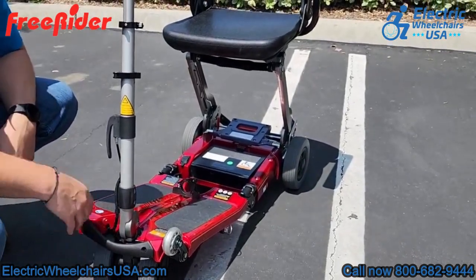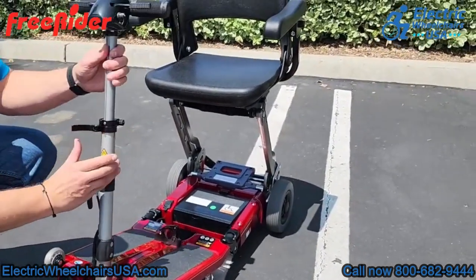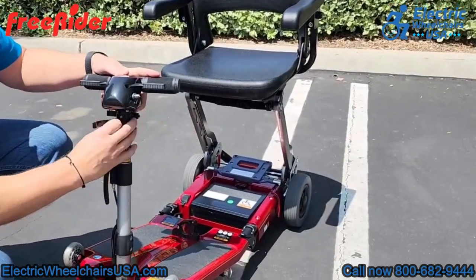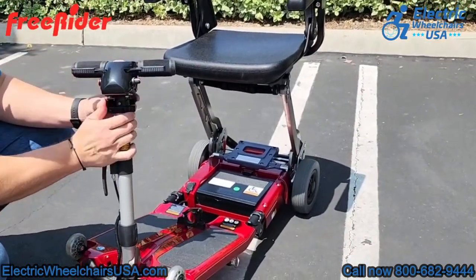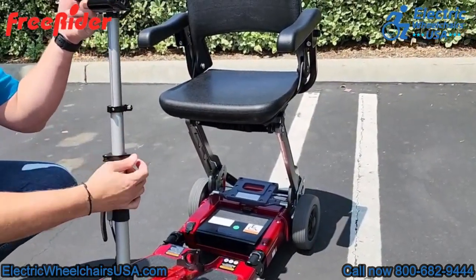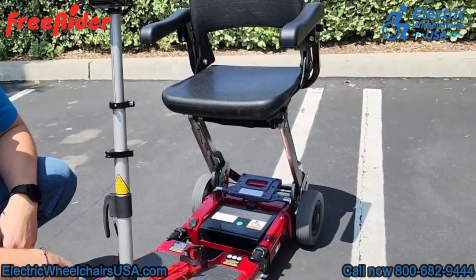The tiller is adjustable in height. There are two clamps that will telescope the tiller up or down, so if you're a taller person the tiller can go up pretty high, or if you're a shorter person you can adjust it down pretty low as well.